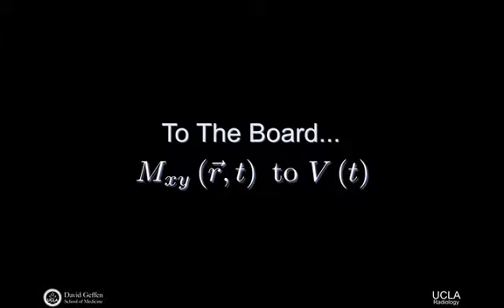If we go from this expression to writing out the two components of the magnetization, we could write out that our MX magnetization as a function of space and time is just equal to some magnitude of the initial condition, which is our MXY naught, which could be a function of space, at what we'll call initial time zero. We would still keep the decay term, so it would still decay according to e to the minus t over T2 star. But if we're talking about just the x component, we're thinking about free precession, then maybe that's the cosine term. So we write it as the cosine of minus omega, which can be a function of space, right? We can change our local Larmor frequency by, for example, turning on a gradient. And so this will be a really important term to keep tabs on today. This is where you begin to see where spatial localization can show up. This is times time, of course, plus the phase from the receiver, or from the RF pulse itself.